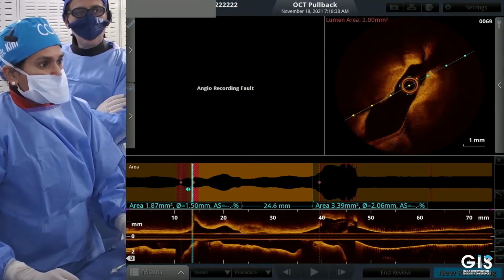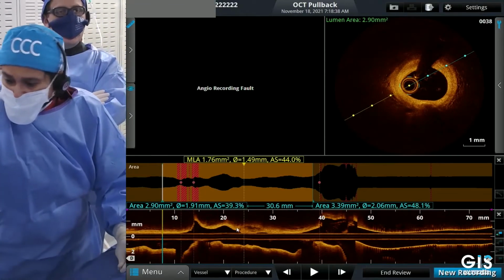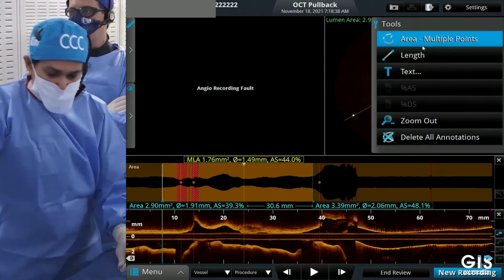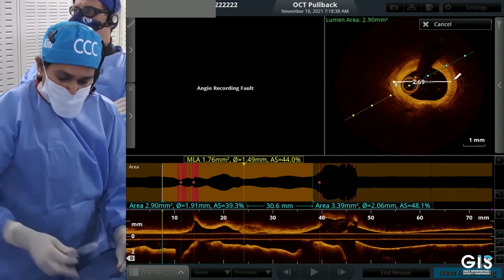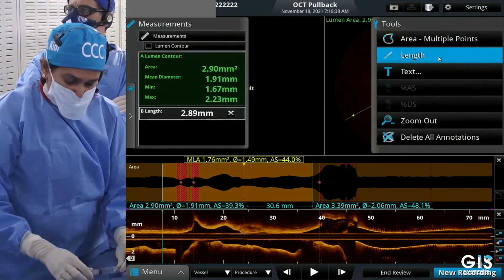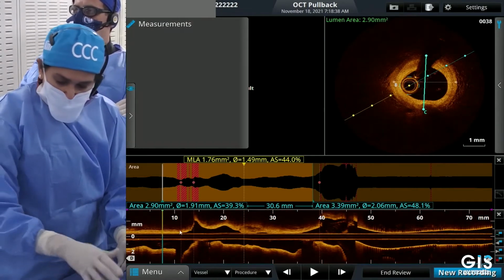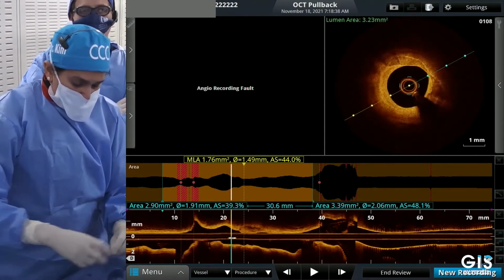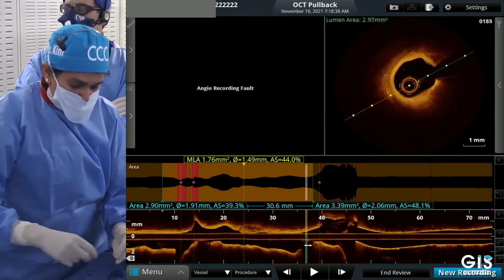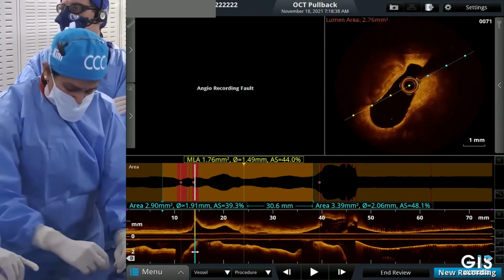So now you follow the cursor at the bottom left as you see how it moves longitudinally, you get a better idea of what's happening. Yeah, and we're going to go to the slides about the app afterwards to understand how the app works and can help everyone interpret these images that are just too many shades of orange, as I say, too many shades of orange. But there is a way to navigate that.